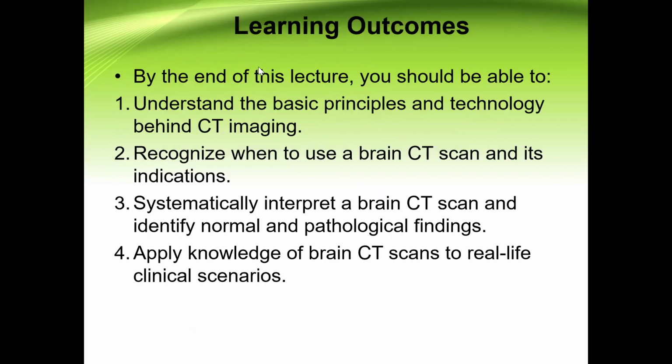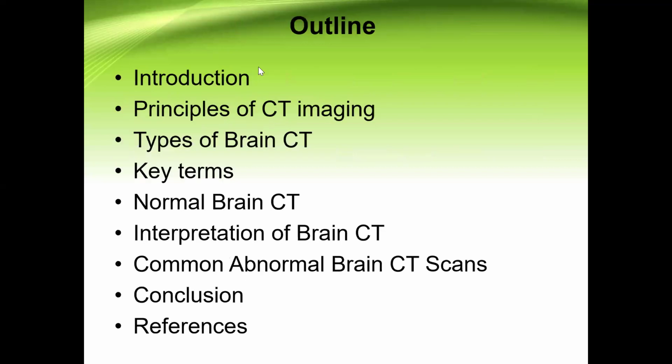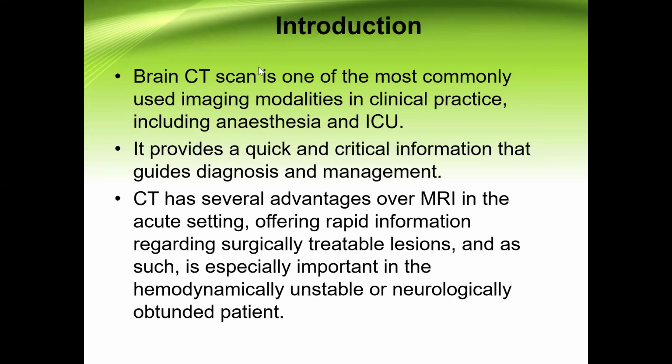So the learning outcomes for today: at the end of this lecture, I expect you should be able to understand the basic principles and technology behind CT imaging. You should be able to recognize when to use a brain CT scan and its indications. You should be able to systematically interpret a brain CT scan and identify normal and pathological findings. And you should be able to apply your knowledge of brain CT scans to real-life clinical scenarios. So we'll follow this outline. All right, so let's start.